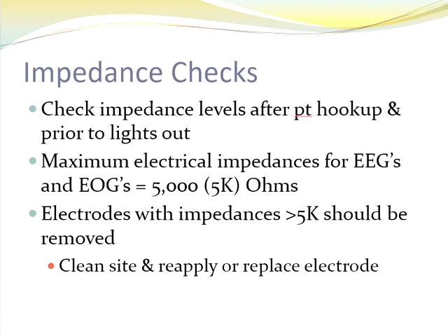Either you didn't scrub well enough, you didn't use enough paste, or the electrode isn't pushed all the way down. Some of you remember when we were practicing in lab, I came through and pushed the electrode down even more on the skin. If you don't push it so it's flush against the skin, it can cause some difficulty with the signal. So there's a lot of different reasons, and it just comes down to practicing to develop those electrode application skills.